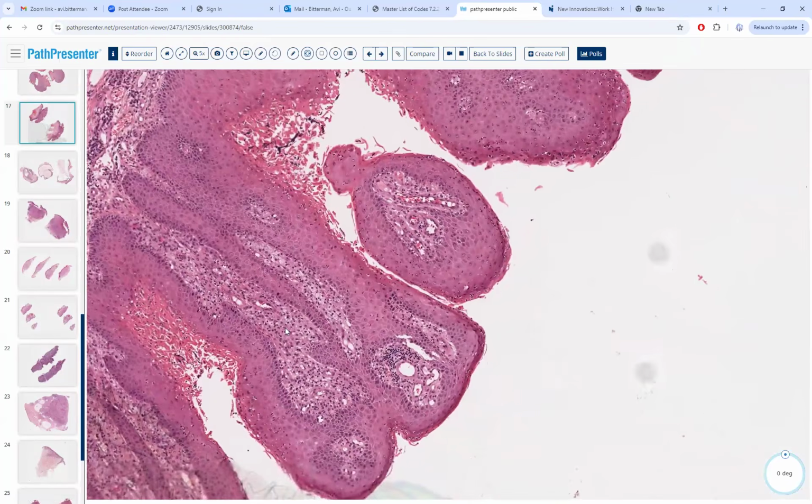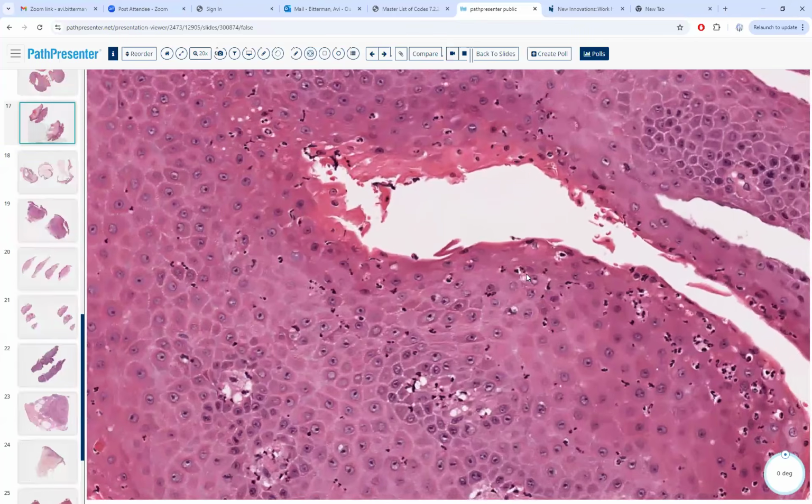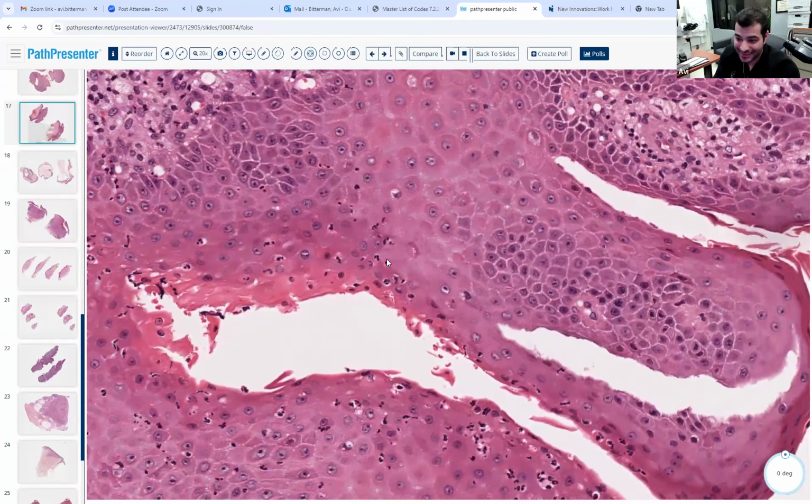For recognizing the neutrophils, someone described them at one point as looking like ants, which I found really helpful. Yeah, and some people say ants, some people say Mickey Mouse. If there's dust, you can call them decapitated ants.